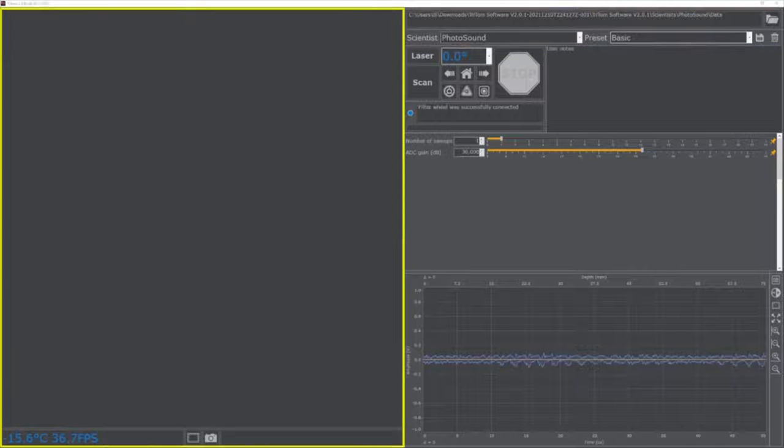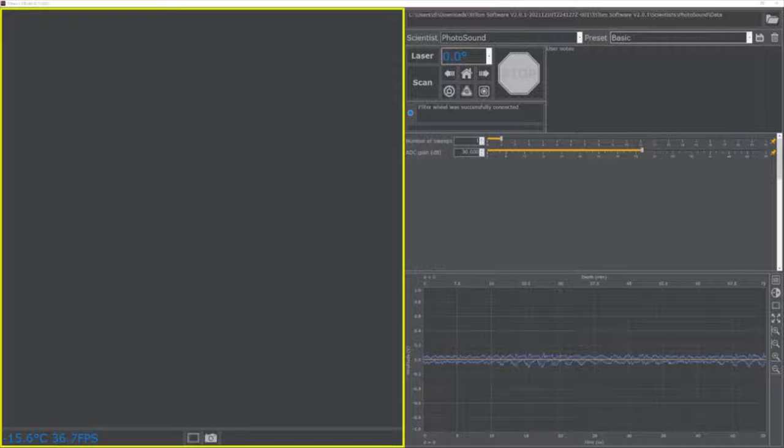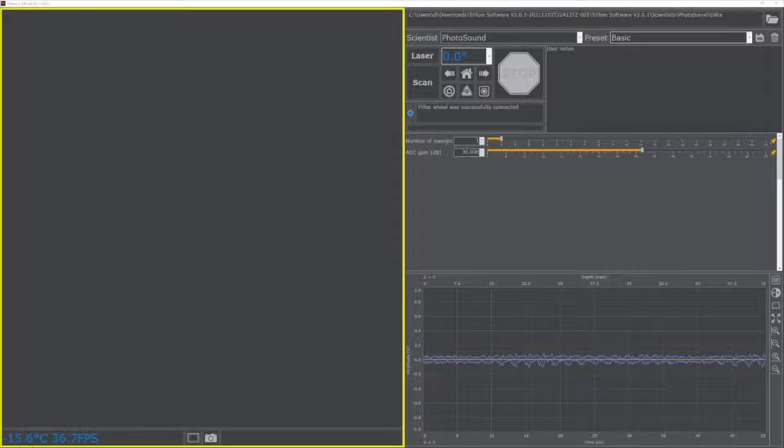The camera viewer shows the live video feed of the Triton imaging chamber. On startup, the camera viewer is inactive because the default filter wheel position is set to closed. This prevents accidental damage to the Triton imaging module.